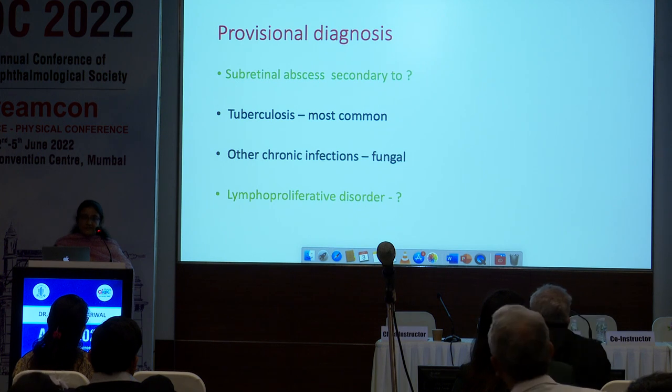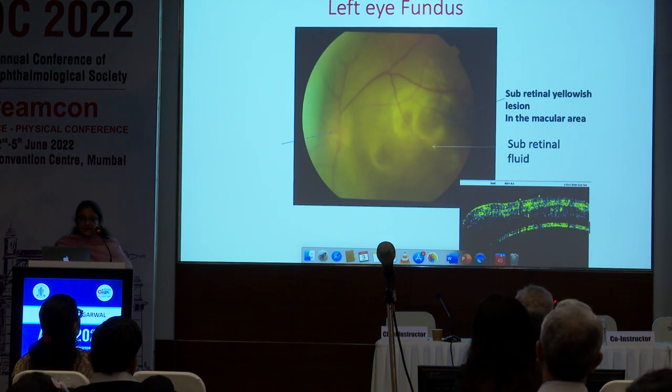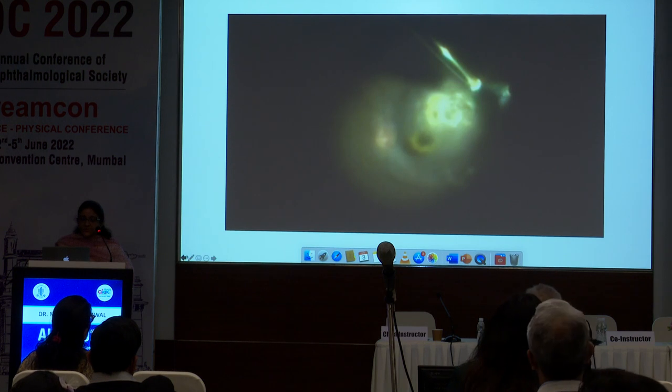And the last thing which we had kept in the differential diagnosis was a lymphoproliferative disorder, being a child. Now, this is the left eye fundus. You again find this, this is what I had shown, a large lesion, very much looking like an abscess. So we were quite lost on the diagnosis of this particular patient.